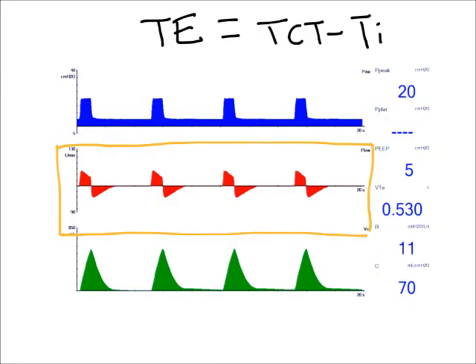So let's say this starts my expiratory time here, and it goes all the way to the start before my next inspiration, where inspiratory flow rises again. So this whole area is my expiratory time, or some people term it as the expiratory phase. So that's my expiratory phase.